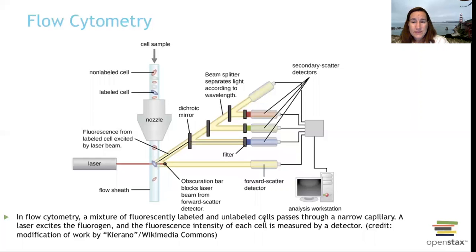Okay, with the fluorescence, how do you pick it up? The fluorescent microscope can pick it up. You can not only detect it just by looking through a fluorescent microscope, but technology is super cool. We can actually count the number of cells. That's important for different reasons that you might need to know. How bad is this infection? Is it just one cell or two, or is there a lot? What's going on? How many are there?